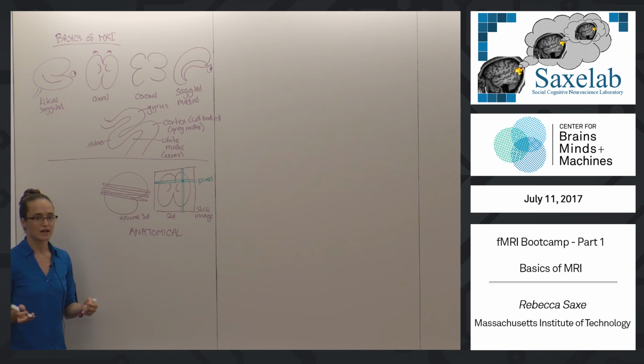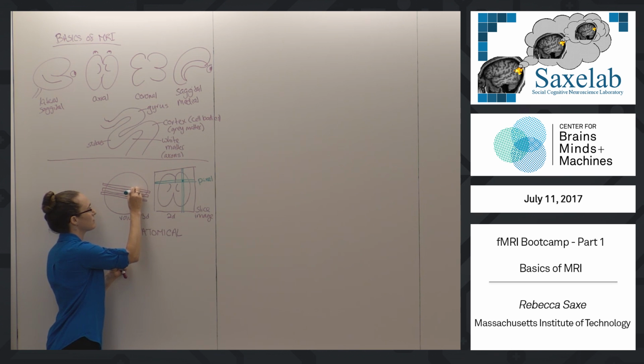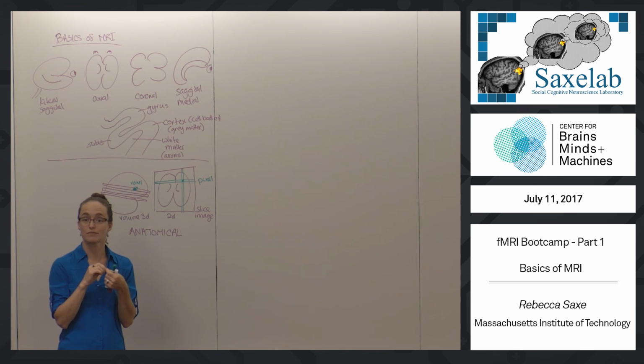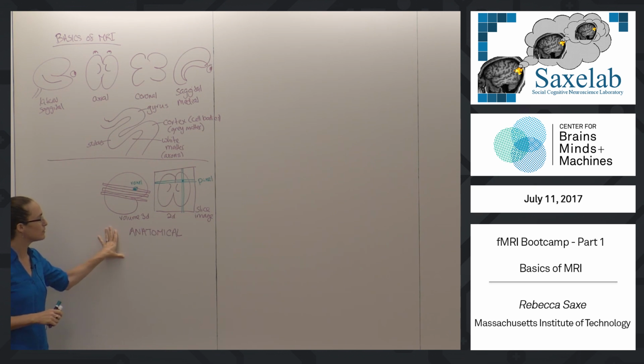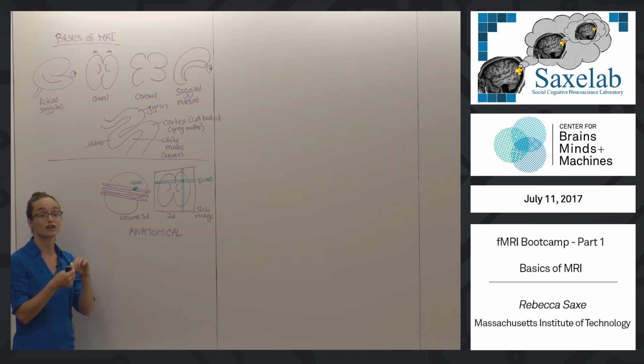Cameras and stuff. Okay, and then when you stack that in a three-dimensional stack so that it's a cube rather than just a square, that's called a voxel. So for anatomical imaging, you're usually trying to get your voxels as small as possible. And sometimes, if it's connectivity, we can talk about DTI if we get there, if you're trying to do connectivity images, then you're trying to measure that voxel as many times as possible.